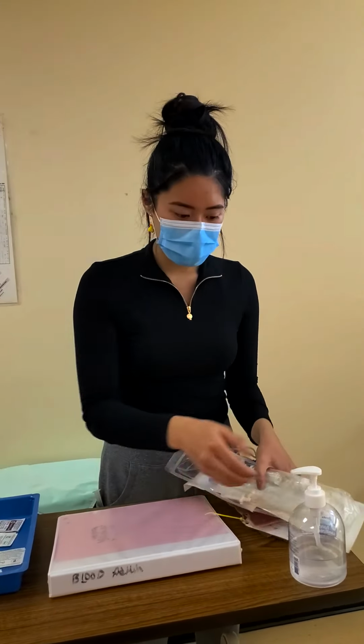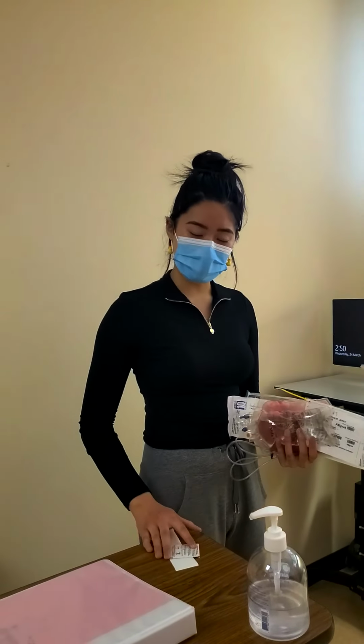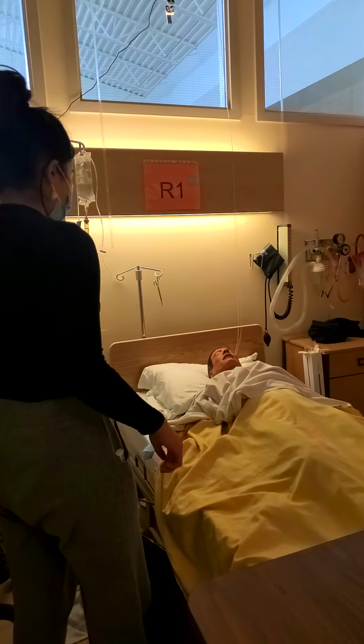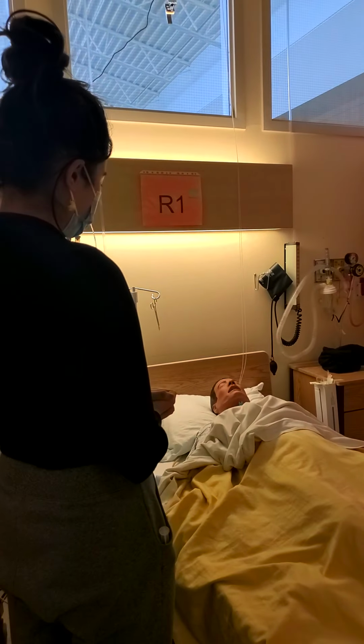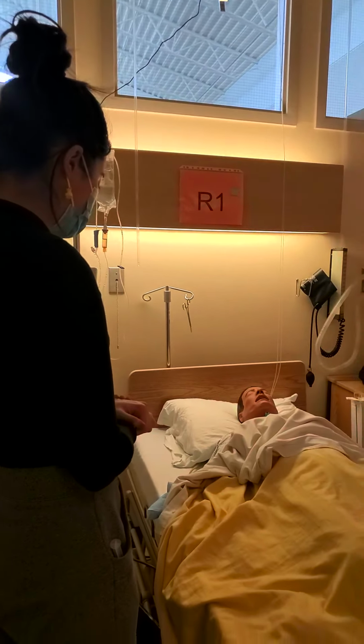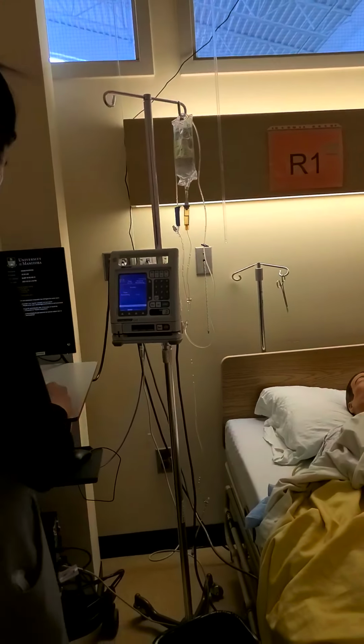Okay. So I'm going to do my hand hygiene prior to entering the room. We're going to do a safety check of the room. Patient non-distress, bed is lowered, environment looks safe to enter, and I'll just introduce myself. Hi Jerry, my name is Julie and I'm your student nurse today, and we're just going to be transfusing blood. Since I have my nurse here, I'm just going to do my checks.